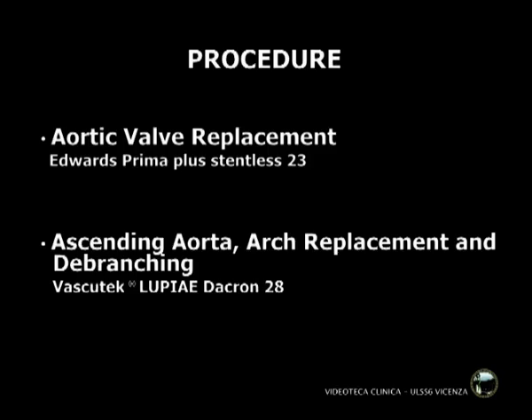Aortic valve replacement with the stentless biological prosthesis Edwards Life Sciences number 23 with the so-called inclusion technique. Replacement of the ascending aorta and the aortic arch with the debranching of the anonymous trunk and the left common carotid artery with the Vascutek Lupia number 28 vascular graft.